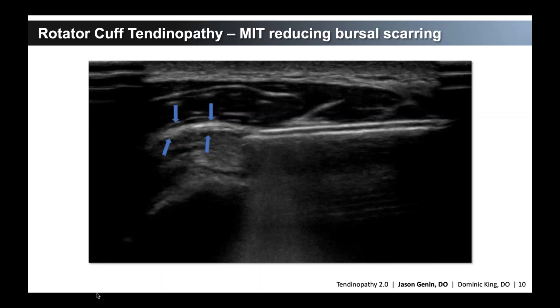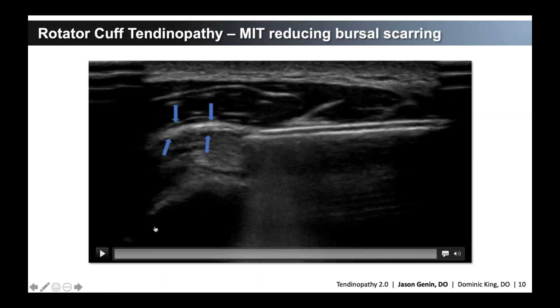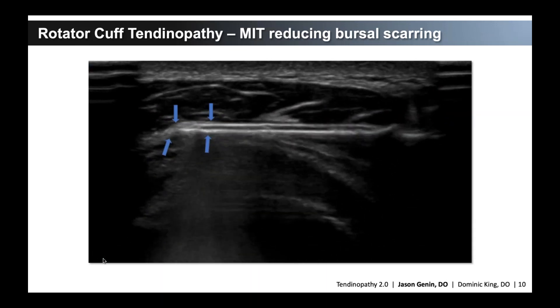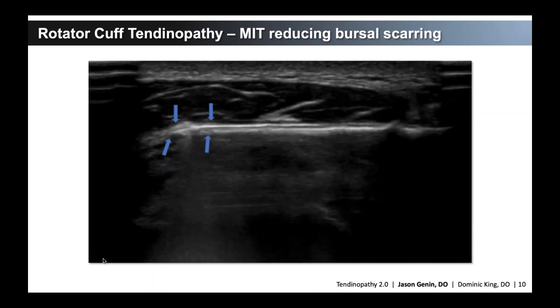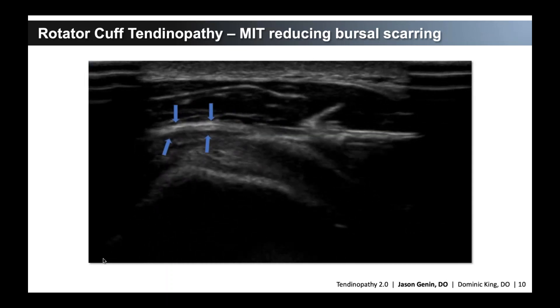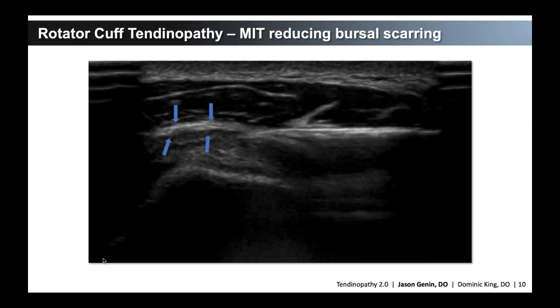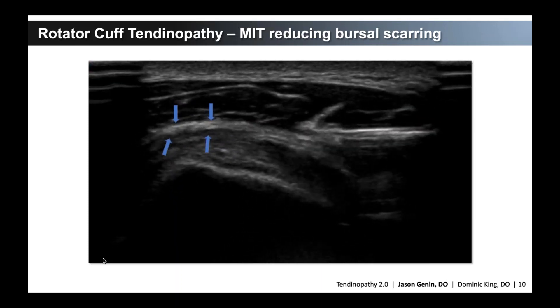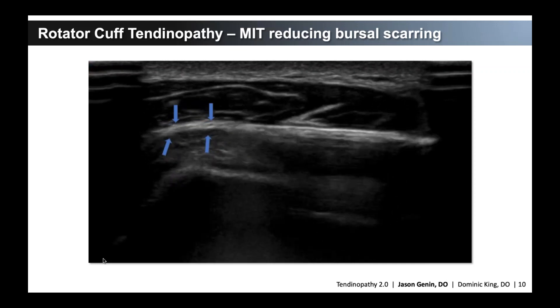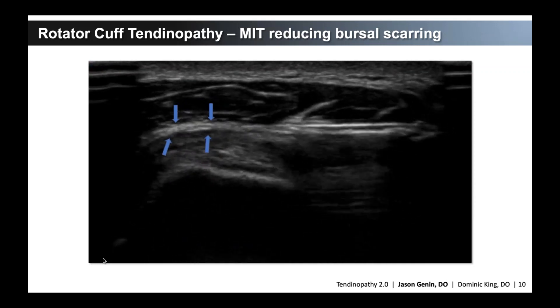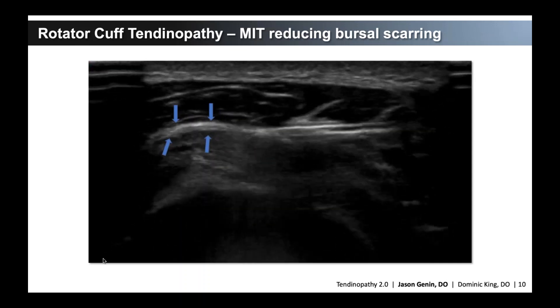We like to start most of our procedures with a debridement of the bursa. I use a rotary technique where I get 360 degrees on the tissue to remove it in all planes, making strong long passes. The bursa will allow for several long deep passes, which can be quite successful.